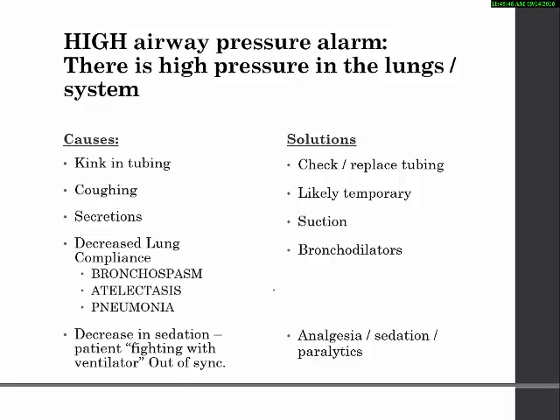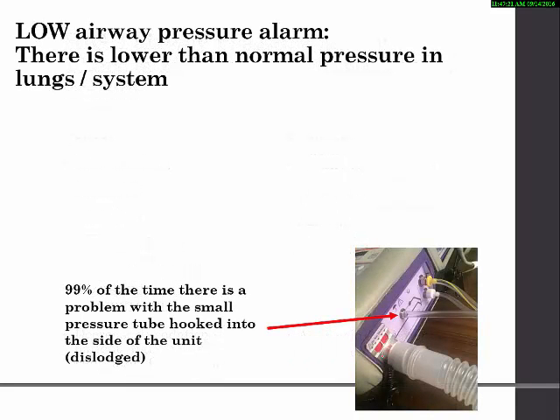And if your patient is waking up and starting to fight with the ventilator, the real response to that, and honestly this is the response to most situations when your patient is fighting the ventilator, is just more sedation. All right, paralytics alone are not good because the patient is still experiencing that anxiety and that fear of having a tube down their throat. So we're trying to sedate them as well. Paralytics help, but the sedation is what we're going to need to do. You may, on a long transfer, find yourself having to up some sedation if they have a drip of some kind running, or you may have to call for orders to administer additional benzodiazepines to make sure that the patients are comfortable during this process.